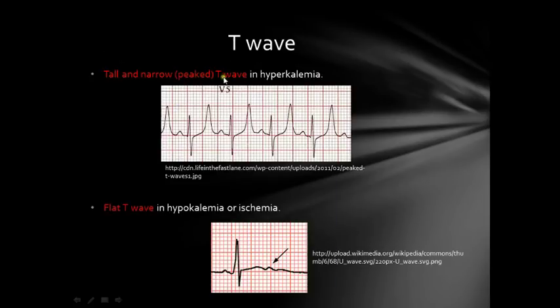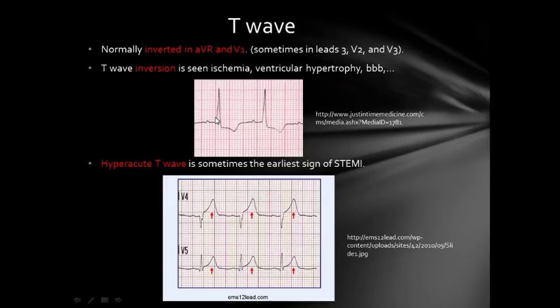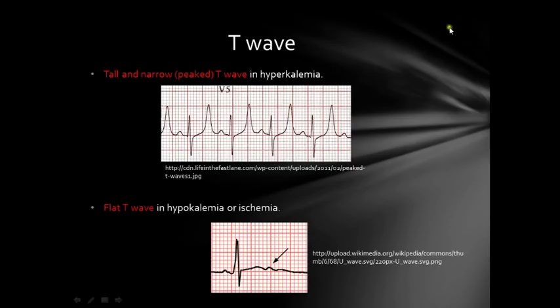A peaked T wave is seen in hyperkalemia — you can see a peaked T wave here. To distinguish it from the hyperacute T wave seen in ST elevation, the hyperacute T waves have a wide base, whereas the peaked T wave in hyperkalemia has a narrow base. The last abnormal T wave is the flat T wave, which is seen mostly in hypokalemia — you can also see a U wave, indicating hypokalemia. So you get a flat T wave and a U wave together.